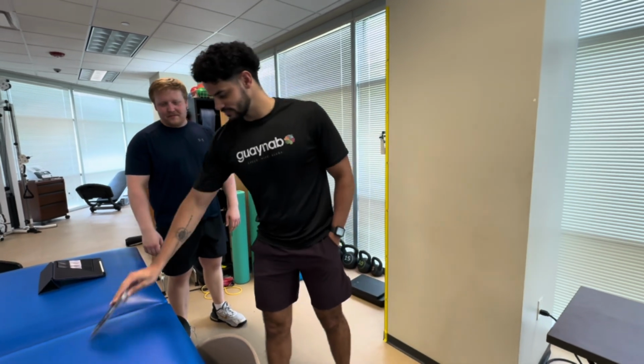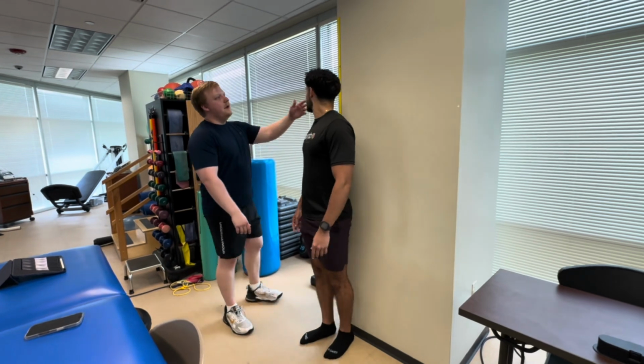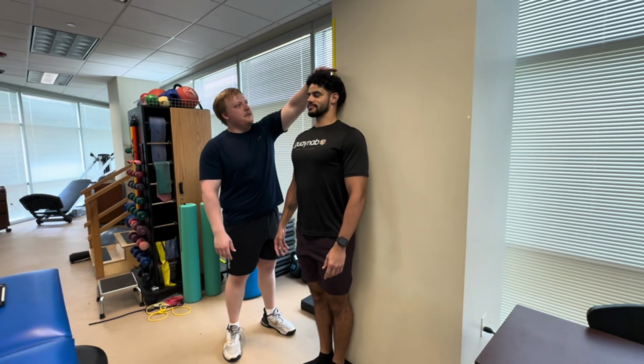In this clip, I instruct John to remove anything bulky from his pockets that would obstruct him from standing flat up against the wall, and to remove his shoes to get an accurate reading of his height.